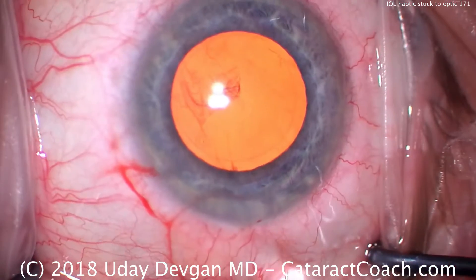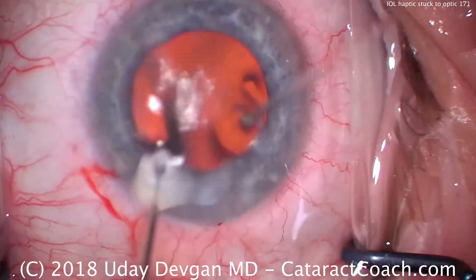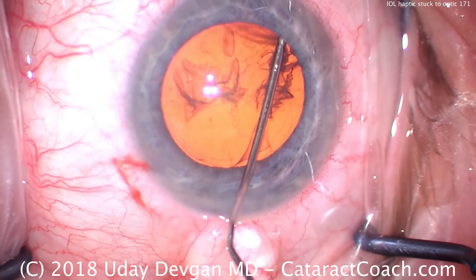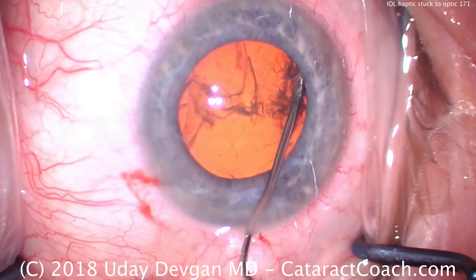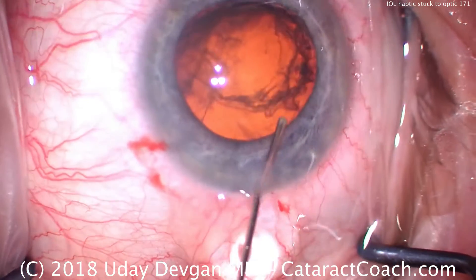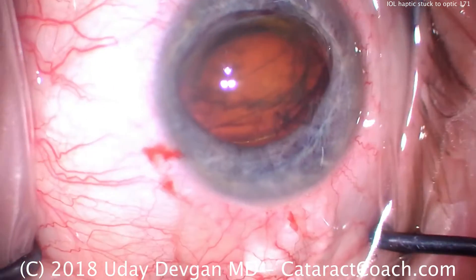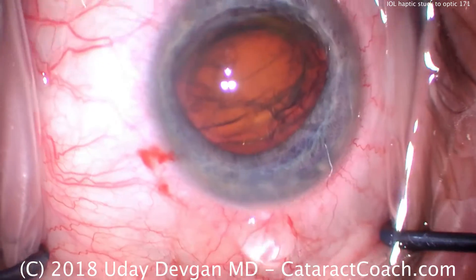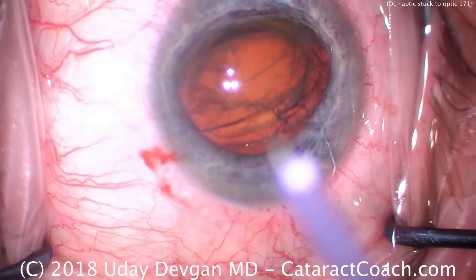That looks great. For our hydrodissection, we're using balanced salt solution on a 27-gauge blunt cannula. We get a fluid wave and we get another fluid wave — it's very important to get those fluid waves. And here we prolapse the nucleus partially out of the bag; it's about halfway in the bag, halfway outside the bag. More dispersive viscoelastic was just injected.